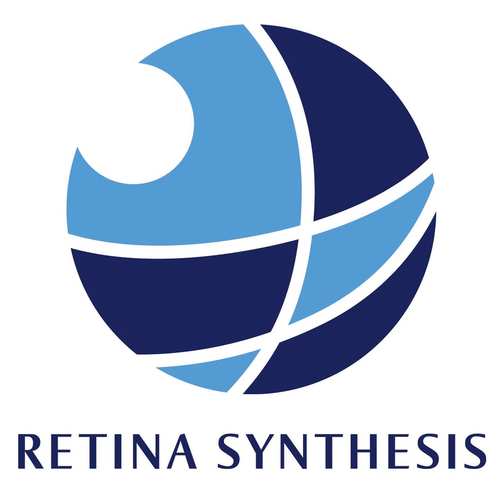But I'll tell you where the big difference is from this home OCT and where the major limitation may be: it's really only the central 3 millimeters. Mm-hmm. So I can get a full macula scan on a Heidelberg. I can go from the optic disc out temporally. I can scan the entire macula. But this technology so far is the central 3 millimeters centered on the fovea. So if you have extrafoveal fluid, it may not pick it up, but it will certainly pick up foveal involving fluid, juxtafoveal fluid, but it's not a whole macular scan.